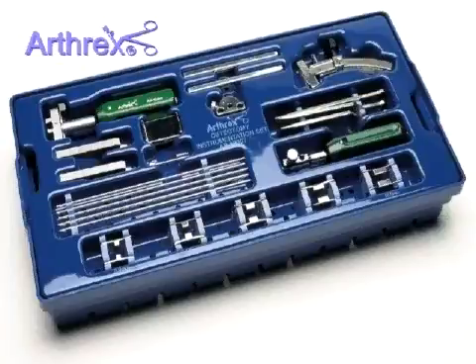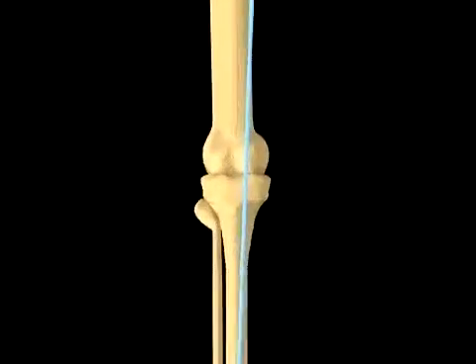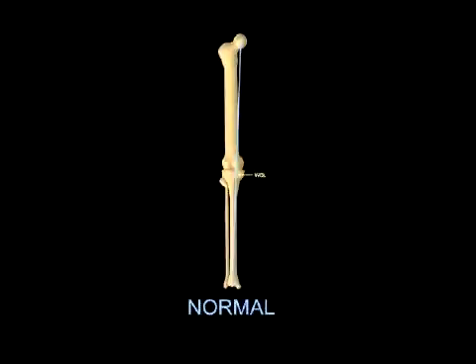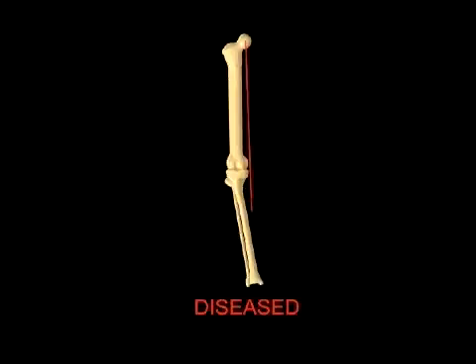For an in-depth description of the surgical technique, contact your Arthrex sales representative for a free video and written surgical protocol. The line of weight bearing, a line drawn from the femoral head to the center of the tibial talar joint in a normal patient, is depicted by this image. The line of weight bearing in this image is typical of a patient with a varus deformity.